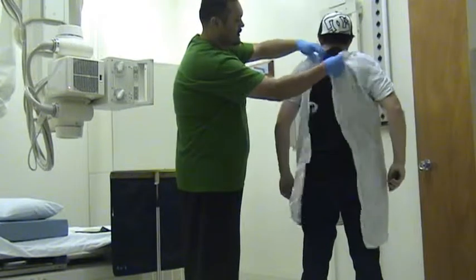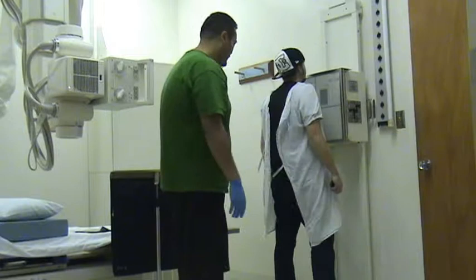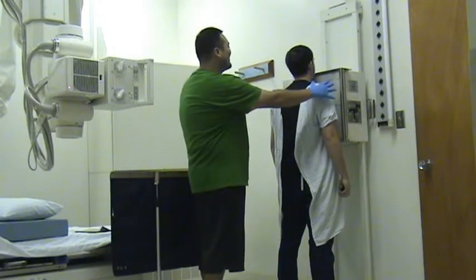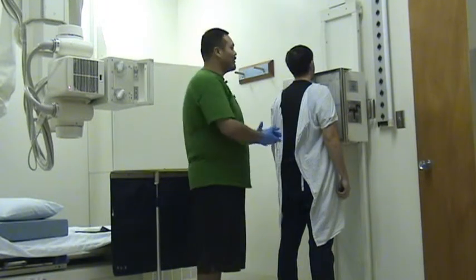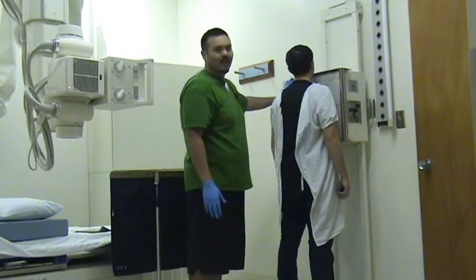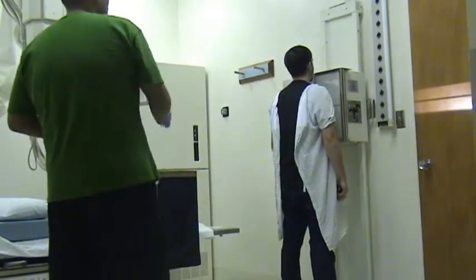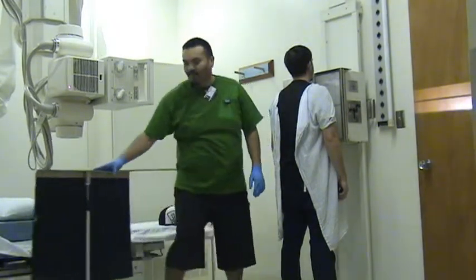All right, there you go. Sir, may you please stand on this board here facing the wall. You want to make sure you center them. I'm going to take this hat off. Look at that, beautiful. You want to center your patient to the bucky. We already had this preset, so it'll make everything run smoothly. You have your left marker outside of the anatomy, marked on the left side as well. Go ahead and relax your shoulders, sir. Perfect, thank you. You want to make sure you center your ray as well. Make sure not to fall like I almost did.